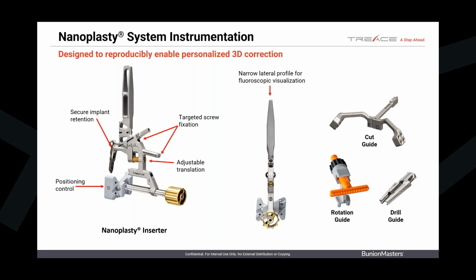So instead of going that route, we created a thin line jig that, on a lateral x-ray, you can see down the shaft. You know that it's aligned. You know it's aligned with the jig, and you're able to get an idea of where your screws are going, where the head is positioned, and that you're all in line.